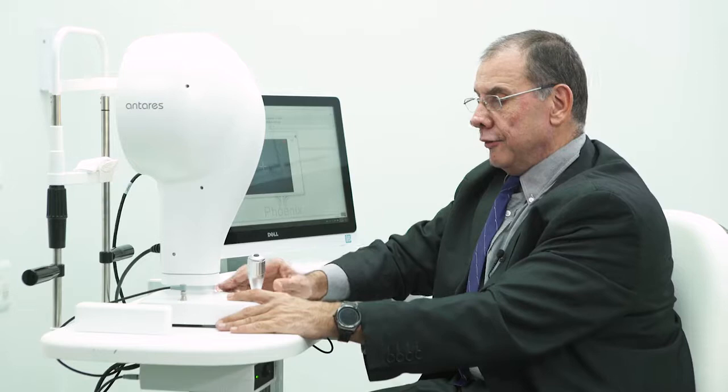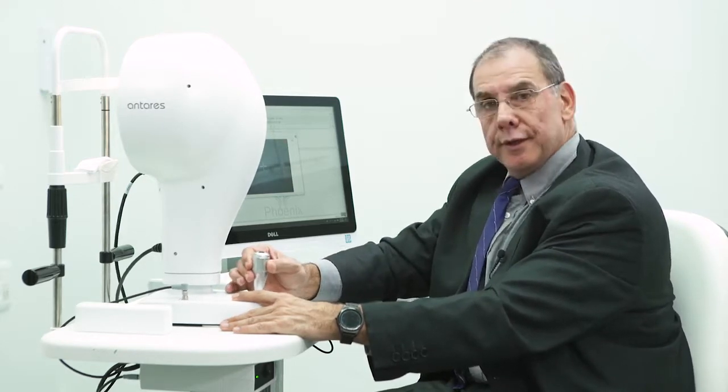We're going to take a patient and do an actual topography. I will show you the method of doing a capture. We're going to discuss it now, and then we'll do it in real time with a patient. What we have to do is use the joystick to center on the patient's cornea.